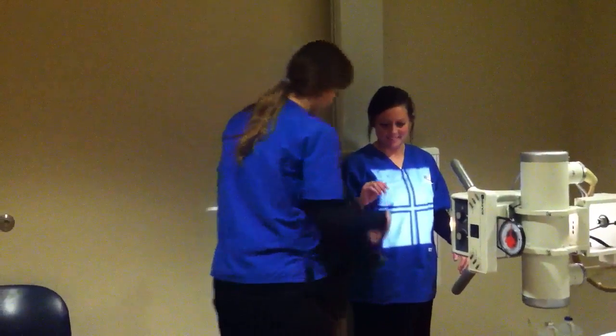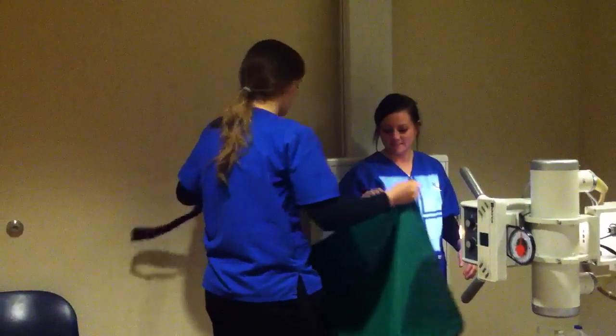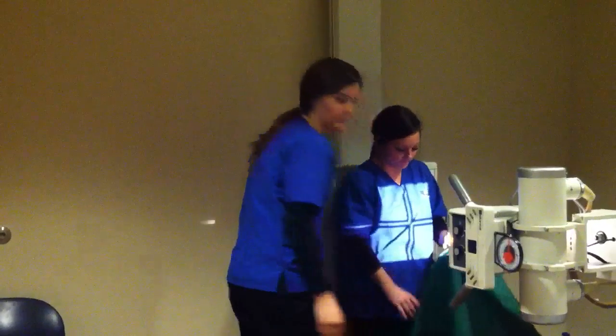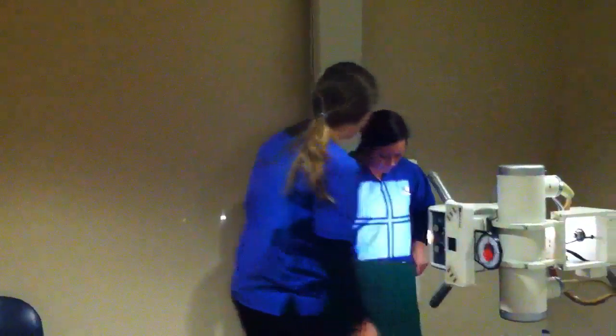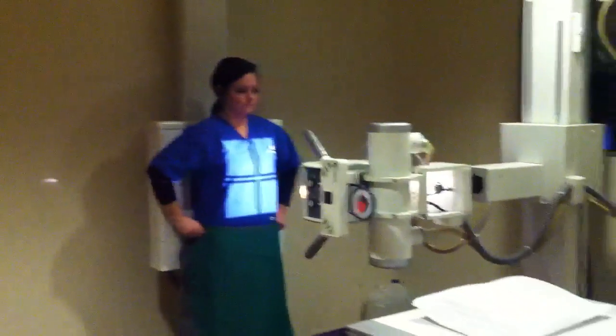Put this shield on. Can you just hold it? Okay. Make sure her arms are out of the way. She's just going to hold that in front of her. And I'm going to measure through the path of the central ray again.